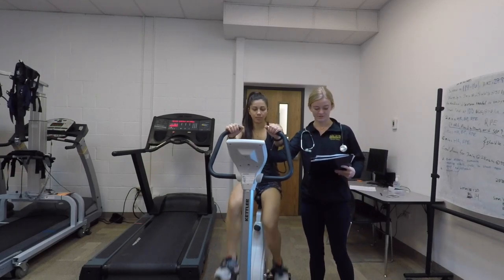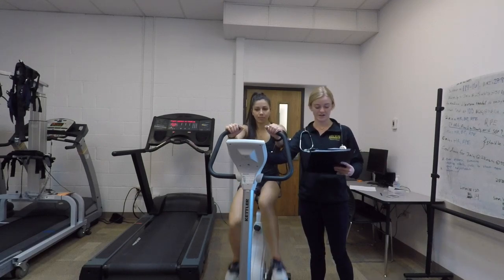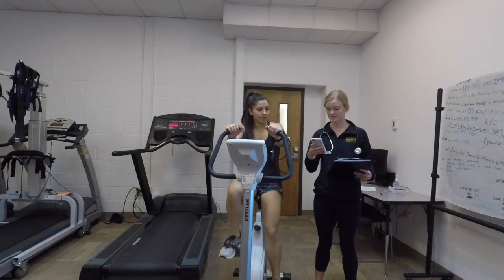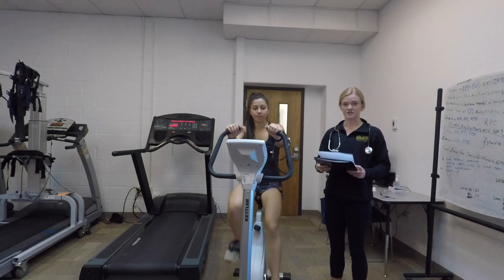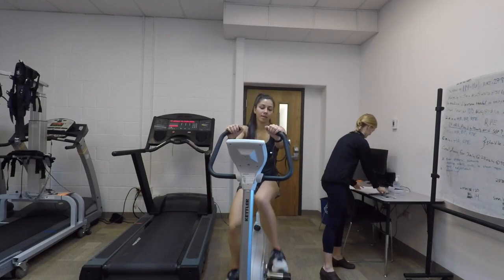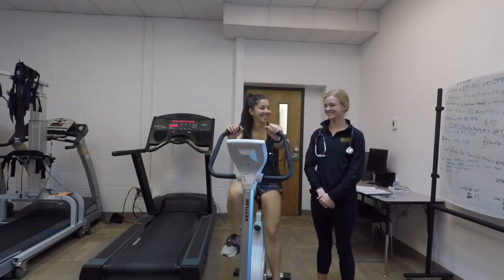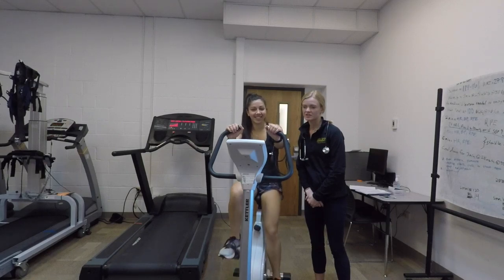And because Alyssa is fit and active, I will increase the workload to 100 watts for the submax exercise test while she maintains a rate of 50 RPM. I'm going to go ahead and start my stopwatch, and we're going to begin the test. I will continue to monitor her changes in blood pressure and heart rate for the duration of 6 minutes as she responds to exercise. Make sure you're maintaining 50 RPM.